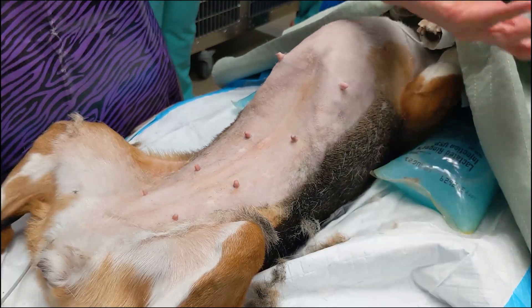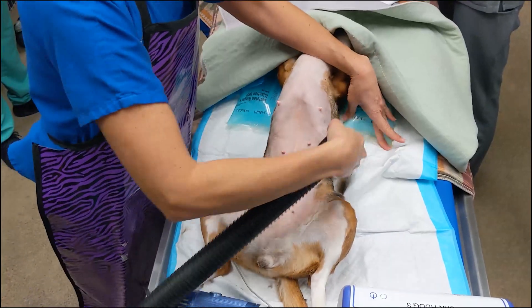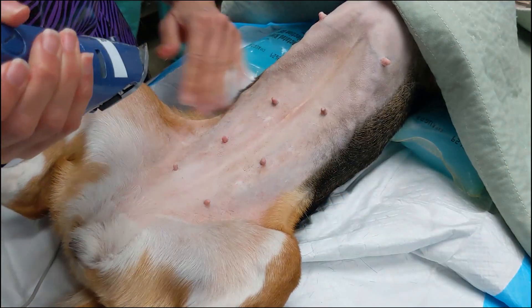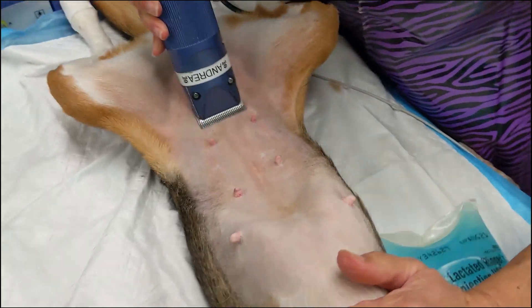Once we're happy with our clip, the clipped fur is carefully vacuumed from the patient and the table to help decrease the risk of contamination in surgery. After you vacuum, you may find some areas that have a little bit of hair left, so you might want to go back and fine tune some areas, particularly where your incision will be.